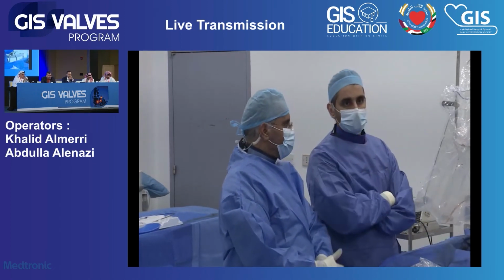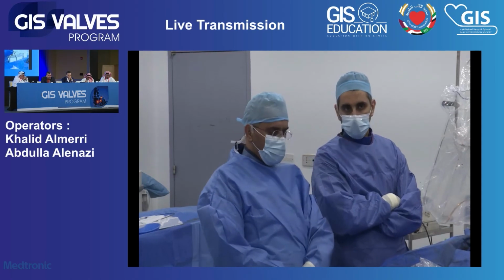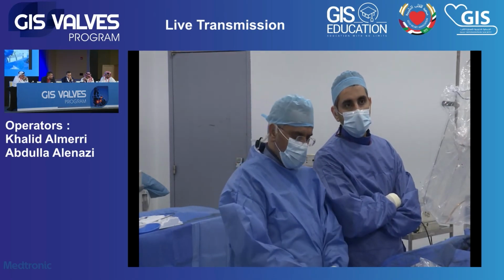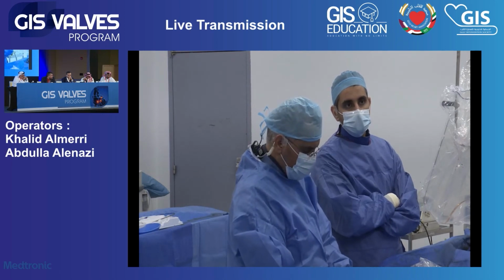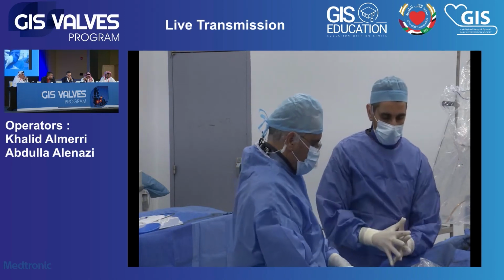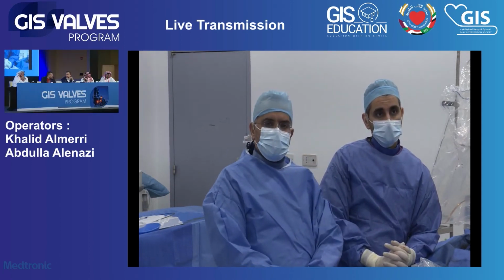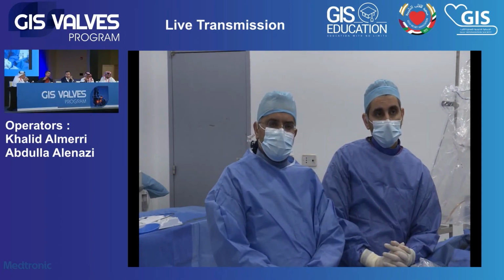Just to go back to the ultrasound. I'm using ultrasound even for venous access. Sometimes when you do a mitral clip or mitral balloon valvuloplasty in obese ladies, I think it's a very good idea to use ultrasound. Yeah, it's very helpful. I agree.